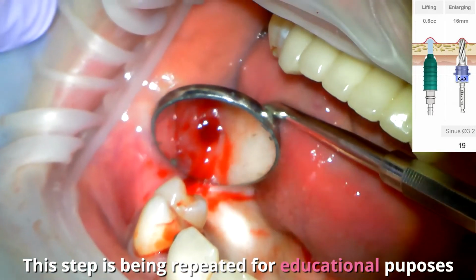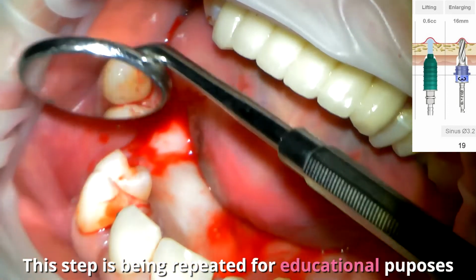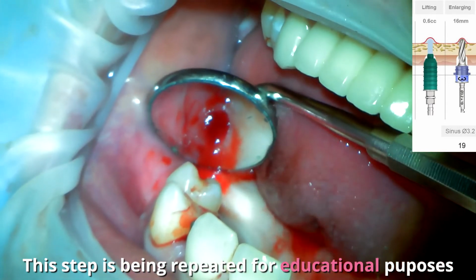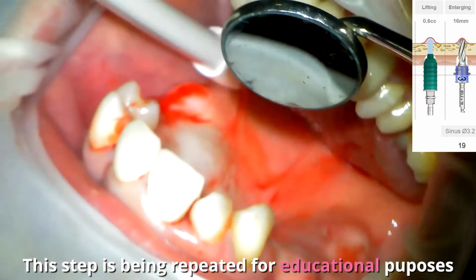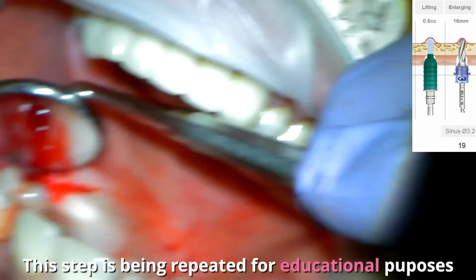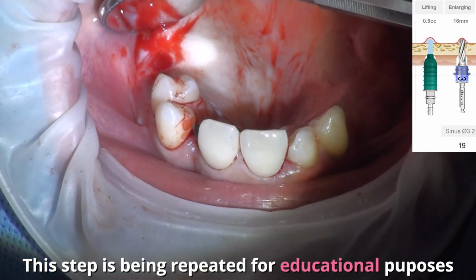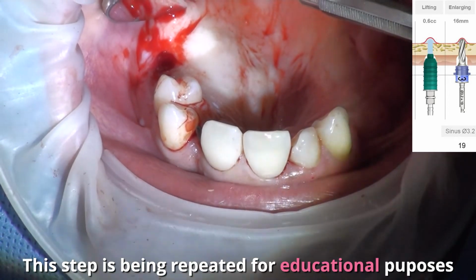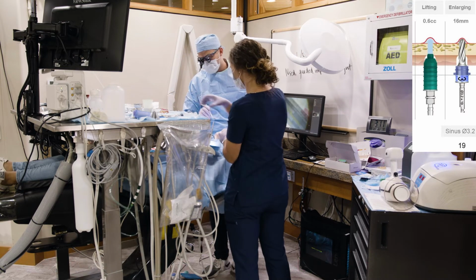So watch this. Plug the patient's nose, blow through your nose. See the water run out. One more time. Okay, a little suction for her. All right, let's try that one more time. Blow through your nose. Good job. So you got to see it run out a little bit more. By creating more patency, you're just able to see the water, I think, flow through a little bit more. No air bubbles. That is called a Valsalva maneuver or a Valsalva test. I'm confident now that we can put bone into the sinus and start putting our implant in without any type of perforation there, because I did not see any air bubbles at all.